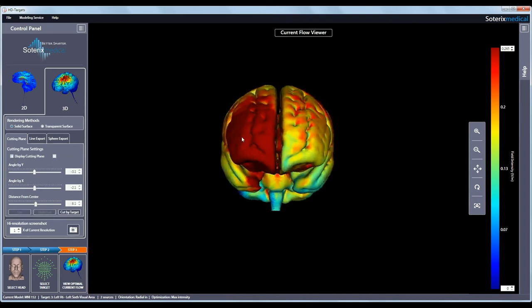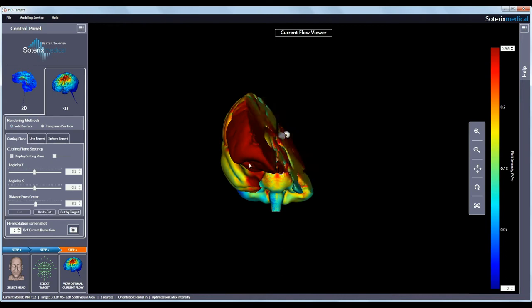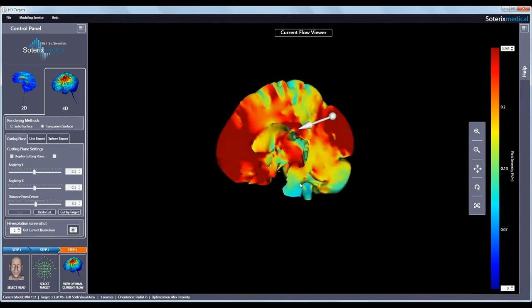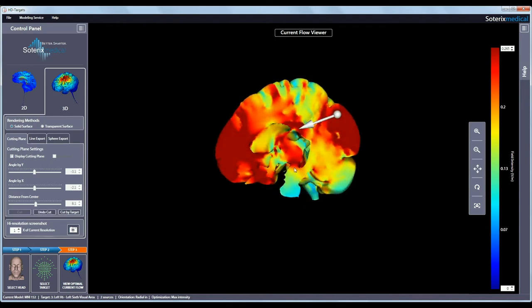By selecting cut by target, the plane will cut the head volume at the location of the chosen brain target in step 2. The white sphere will show the indicated target location while the arrow shows the selected field orientation.